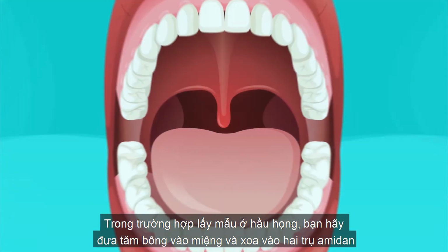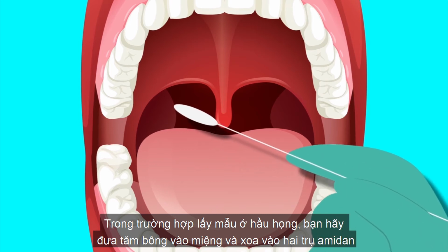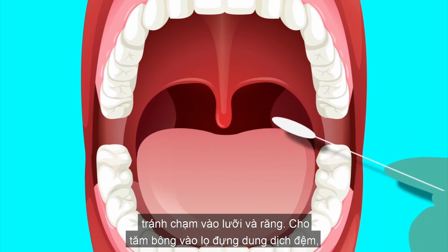The patient should not feel pain during the procedure. In the case of an oropharyngeal swab, insert the swab into the mouth and rub the 2 pillars of the tonsils. Avoid touching the tongue and teeth.